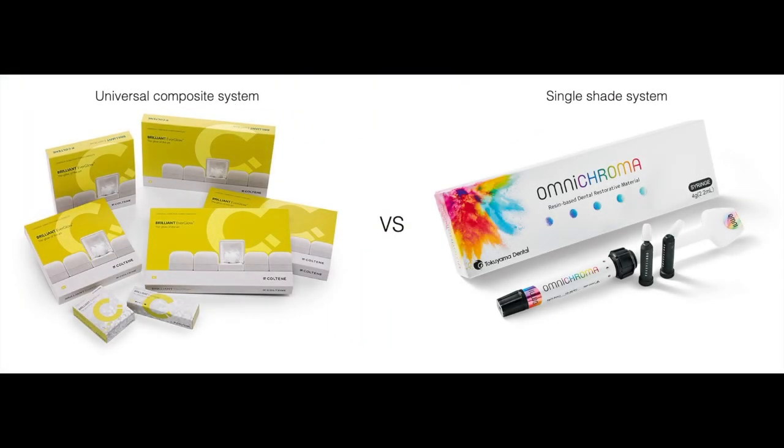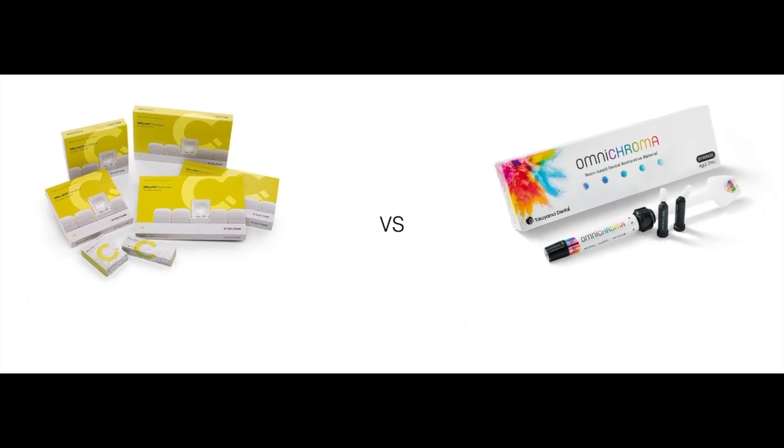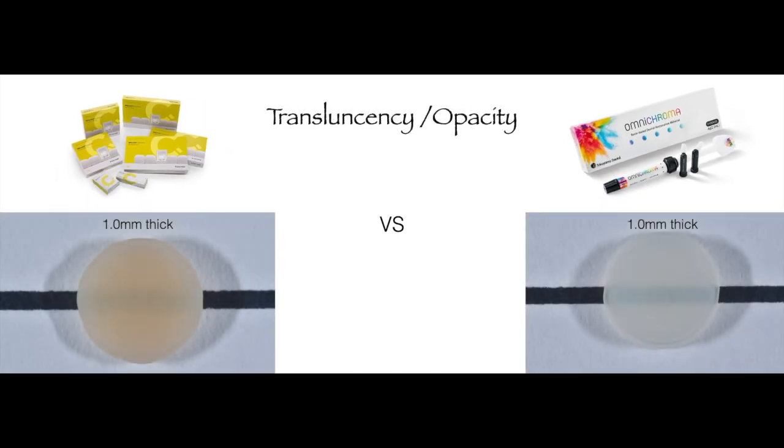So with this information in mind, let's compare a universal composite system like Brilliant EverGlow from Coltene to Omnichroma single shade restorative system. First, let's look at their translucency and opacity. Here we have two 1 millimeter cured composite discs. On the left, we selected A2B2 from Brilliant EverGlow, and on the right is Omnichroma.